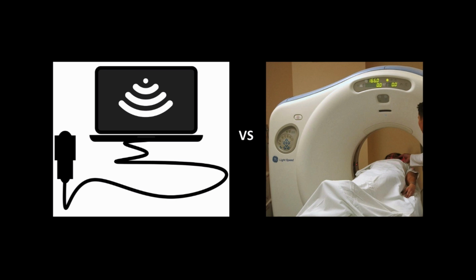The days of taking a patient to the OR without imaging have very nearly ceased to exist. With that in mind, the treating physician decided to obtain laboratory studies and wanted imaging to confirm his suspicion of acute appendicitis. Ultrasound was selected as the initial imaging study given the patient's age and desire to limit exposure to ionizing radiation. Here are the images obtained by Dr. Lupo.